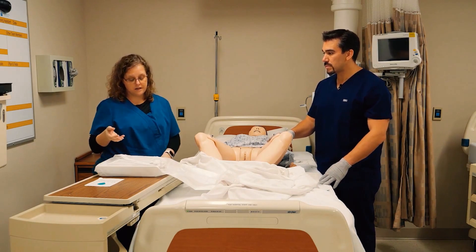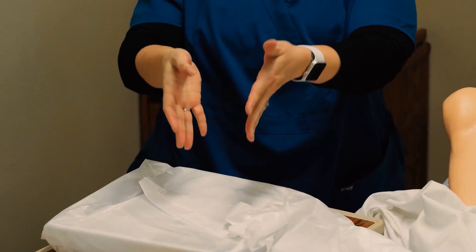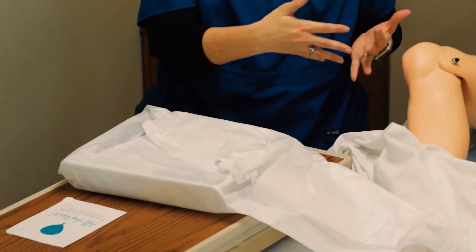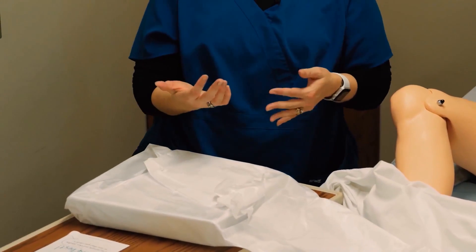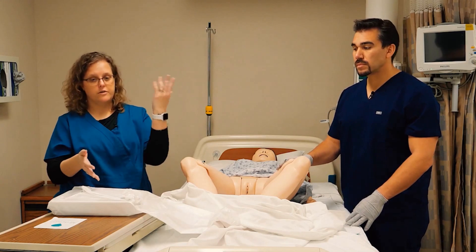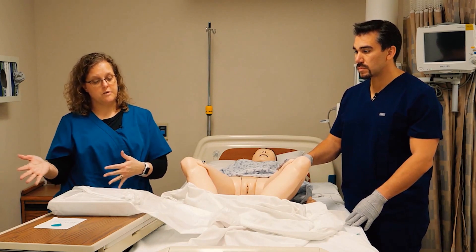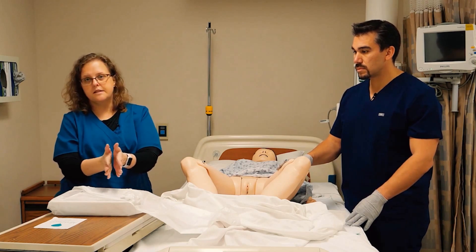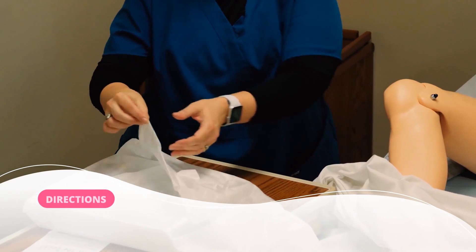I'm going to take off my gloves. A lot of kits will have something right here for hand hygiene, since you've done a dirty procedure first. Ideally, you'll have some hand hygiene available — whether it's alcohol or you need to step away and wash your hands before opening your kit. Ideally, you just have some hand sanitizer right here.